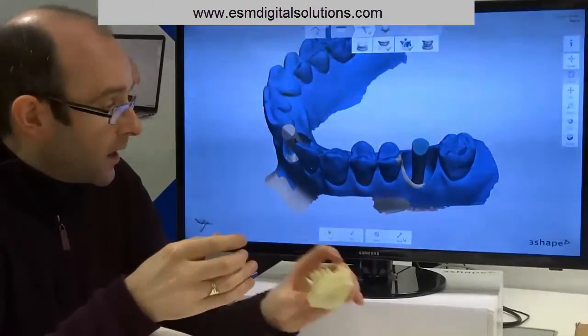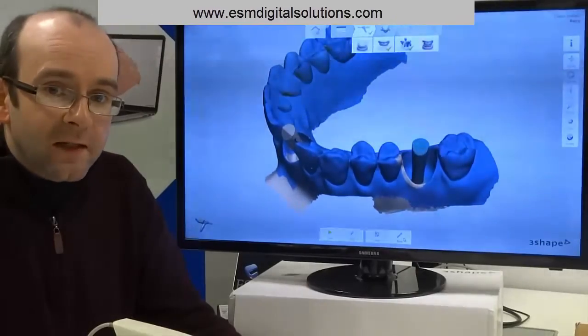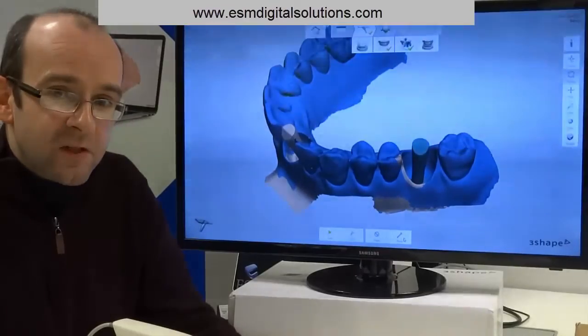So I hope you felt that those were some useful tips and pointers for scanning implant cases, and I hope you get lots of practice at carrying out some successful implant scans.